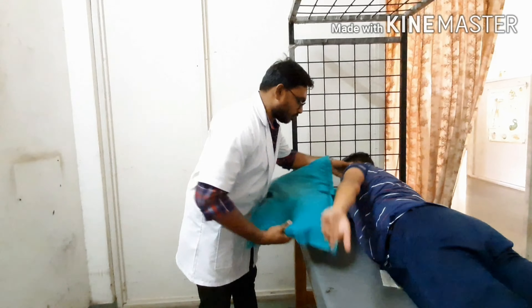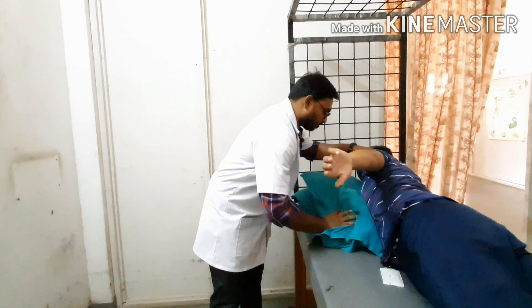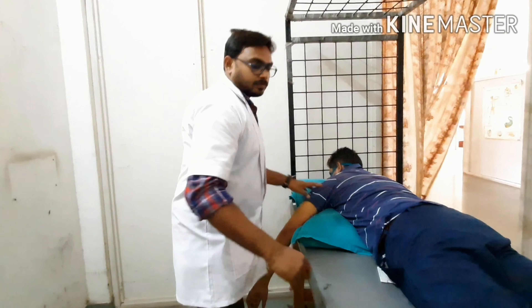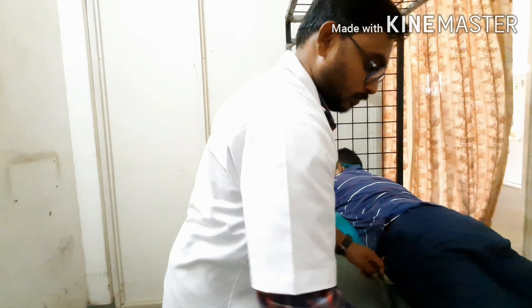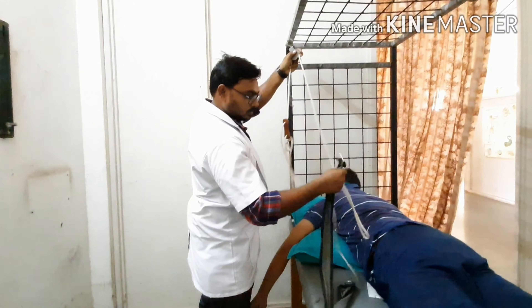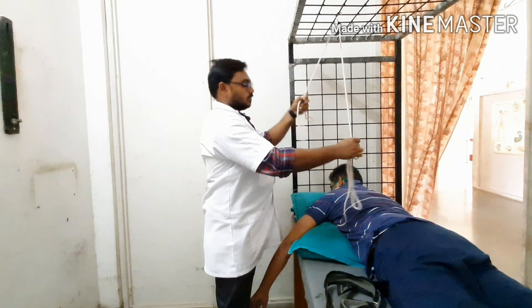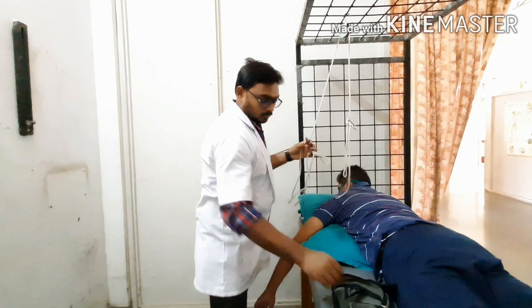Alternative position for shoulder joint abduction and adduction: the starting position is prone, with a quarter turn toward the side, with a pillow under the trunk on the side of the arm to be moved. The sling and rope arrangement are the same as in the supine position.